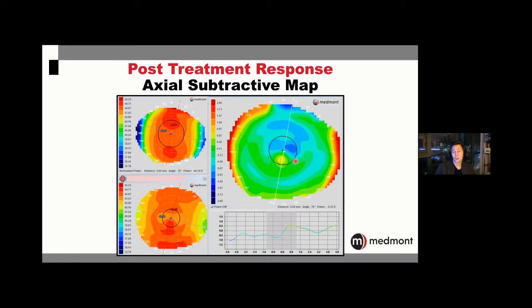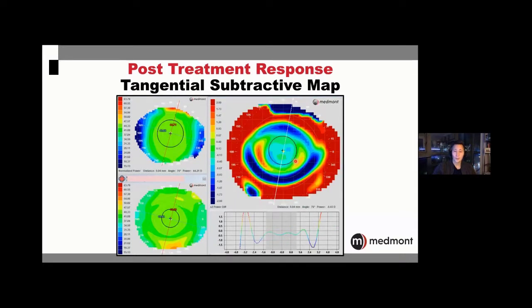Now, although this was short-term wear, we really need to go longer to prove out whether this lens can achieve full effect. Remember, for those of you who don't do a lot of ortho-K, full effect is 7 to 10 days, so rushing to conclusions after 1 day might not be the thing to do. But I'm thinking based on the fluorescein pattern and how the lens appears to want to be high, the lens didn't appear to align 360 degrees around. We'd have this meridian where it could rock, and our topography after one night is showing us kind of a tilted effect, a little more treatment up top versus down below. Maybe I want to consider refitting.